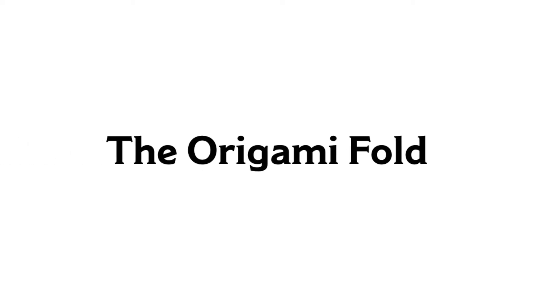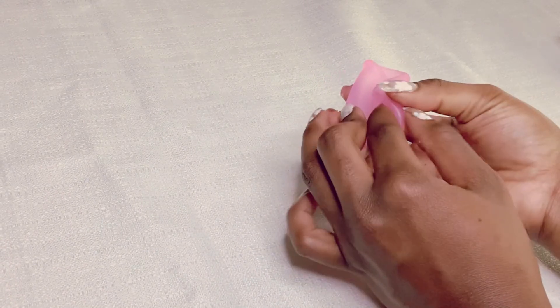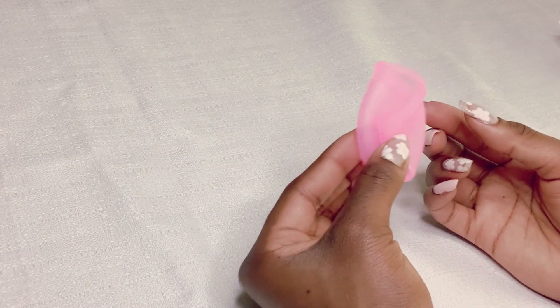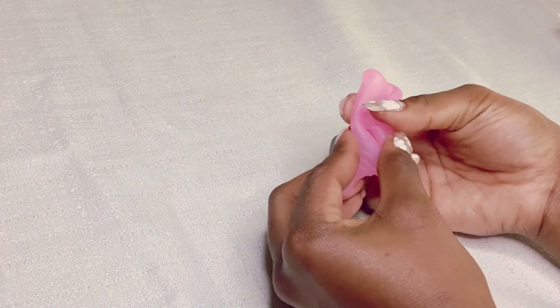Lastly, we have the origami fold. If you've never done origami, this is a starting point. To do this fold, it's similar to the punch down. You want to start with a half punch, then twist it around to create a rosebud. This will also create a little nub at the base of the cup to push on in order to get the cup to pop open.